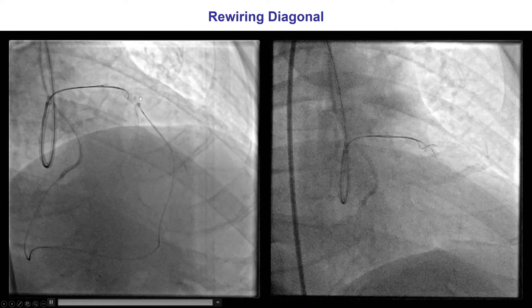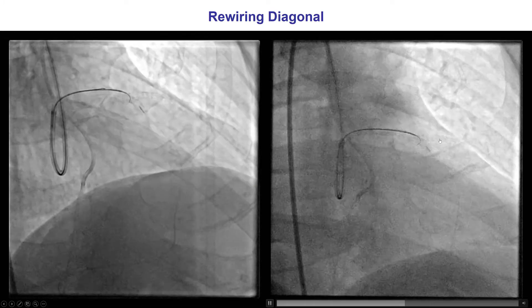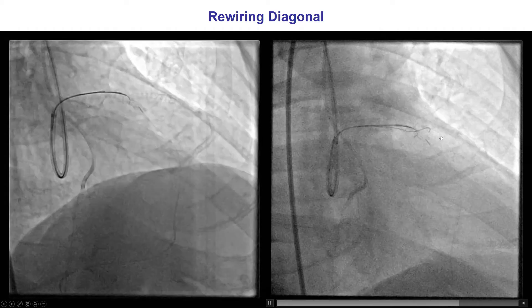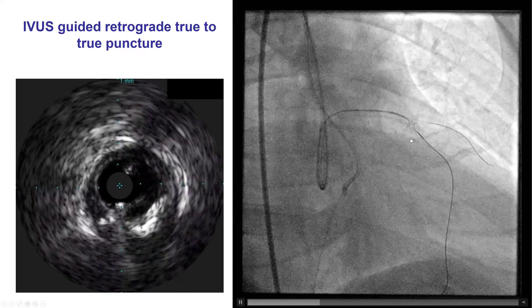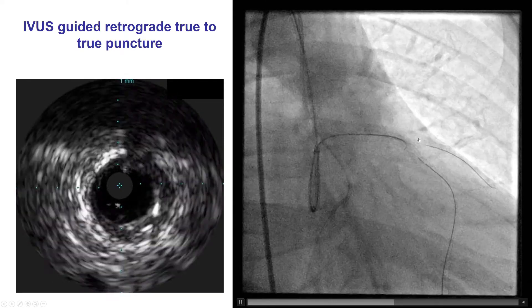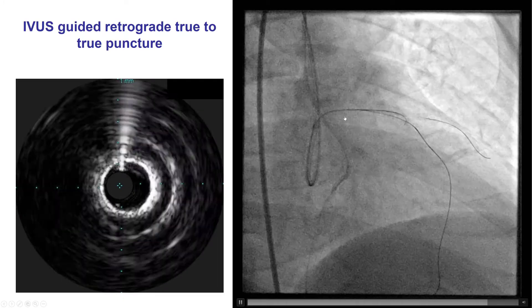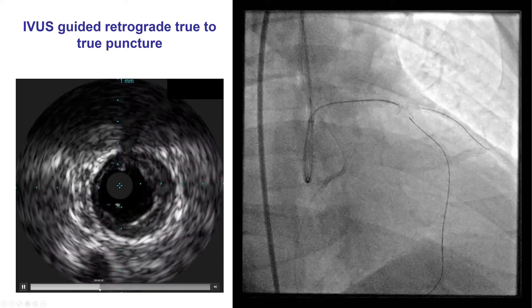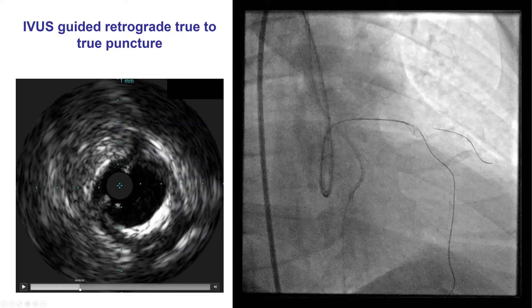Before doing any further attempts, we wanted to make sure that the diagonal was protected. We therefore inserted a workhorse guidewire into the previously stented diagonal branch. Given the short occlusion length, we decided to try retrograde true-to-true crossing. With a Pilot 200, we were able to advance it into the proximal true lumen, and this was confirmed by intravascular ultrasound demonstrating that the wire was in the true lumen.